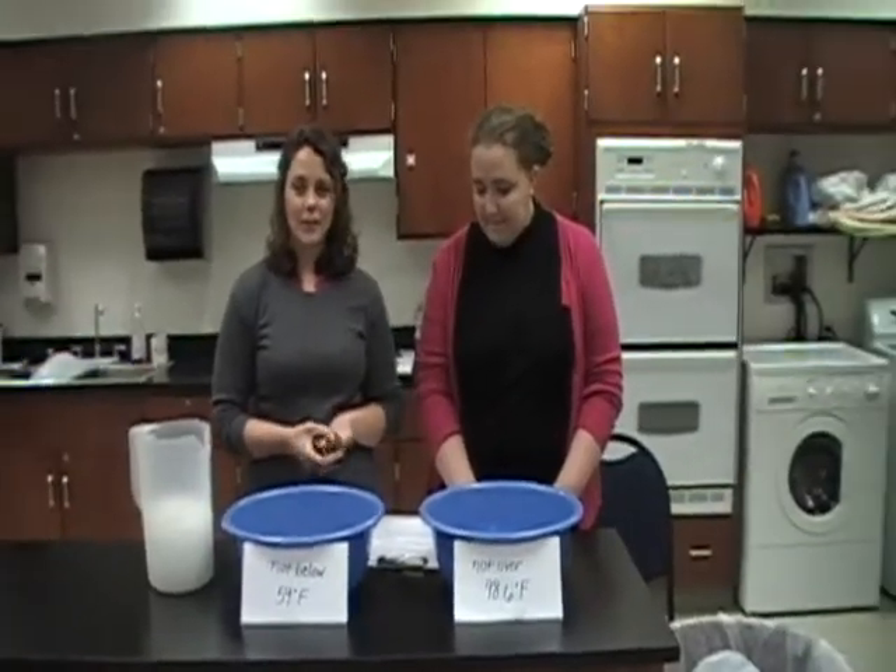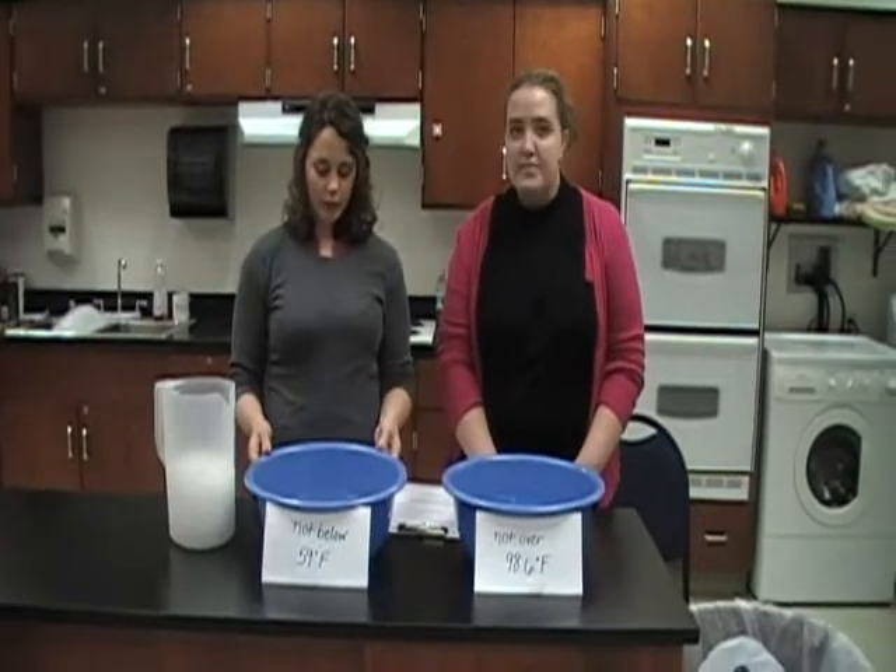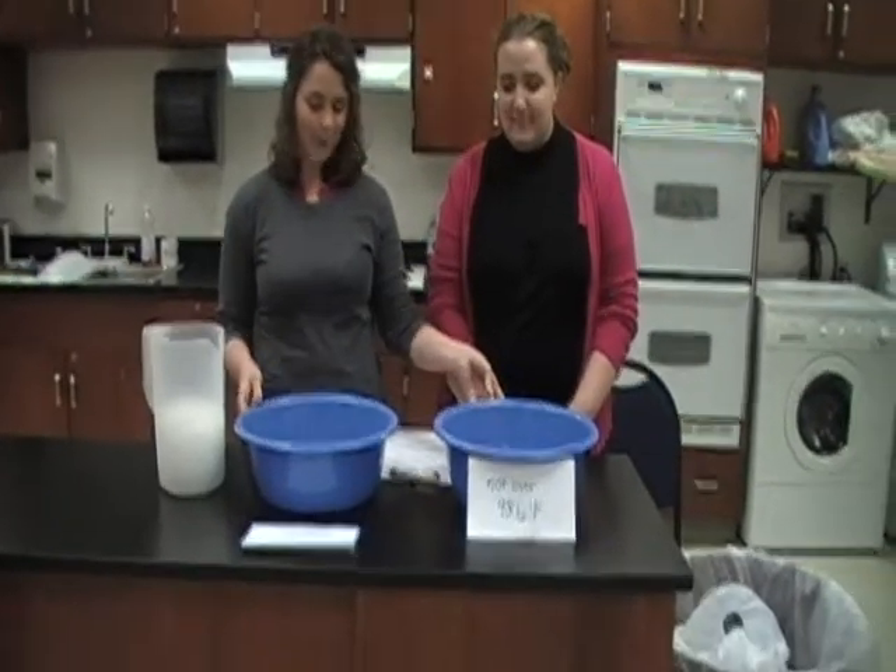This is the contrast bath. You would use this with someone who has edema, and you're going to start with two bowls of water, one with cold water and one with warm water.